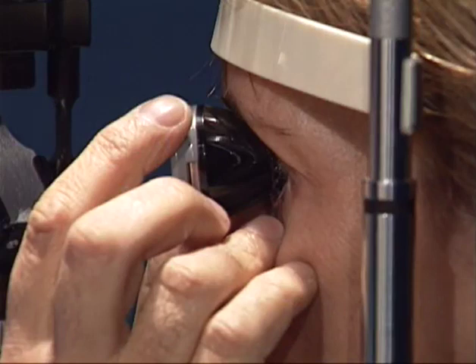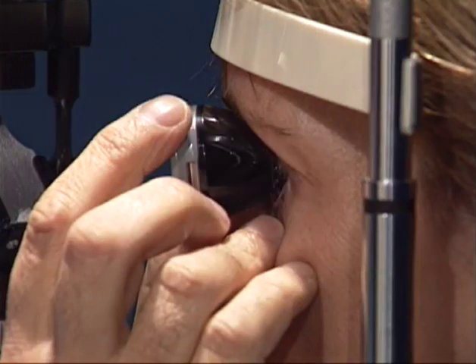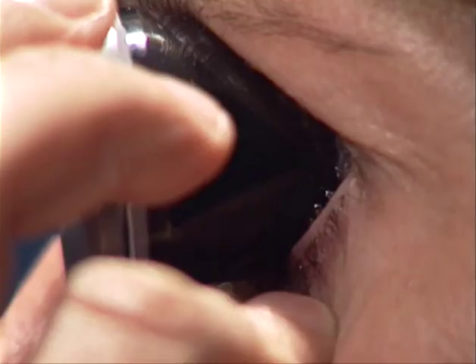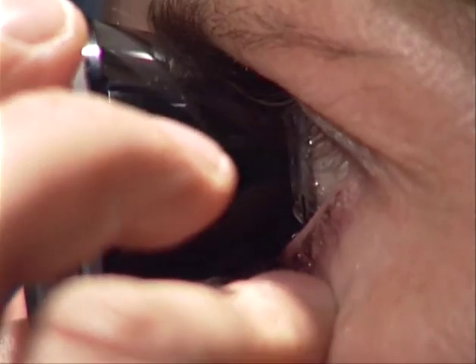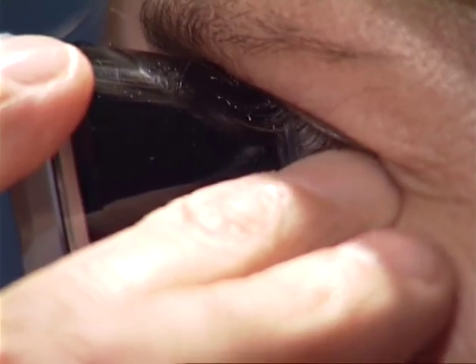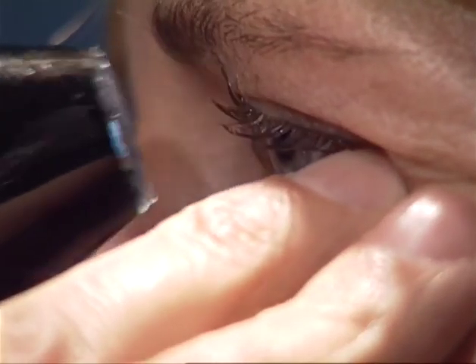Removal of the contact glass requires the release of the negative pressure which may have developed in the cavity of the contact glass. In case of low suction, the contact glass gives way easily at the slightest pull. In case of strong suction, however, the globe will follow the contact glass on retraction. Sometimes such strong suction may be recognizable by conjunctiva being sucked into the cavity beneath the contact glass. To avoid damage to the cornea, the suction should be released by pushing the fingertip towards the globe just adjacent to the contact glass to let the air penetrate into the cavity.